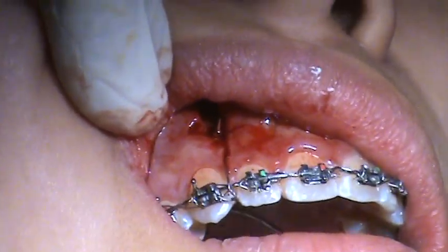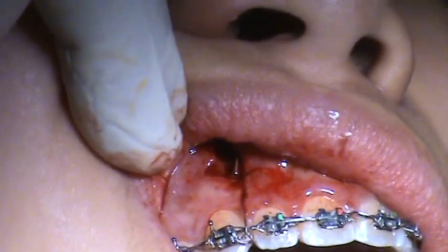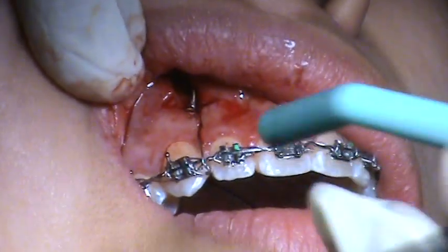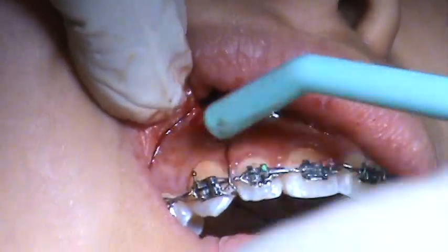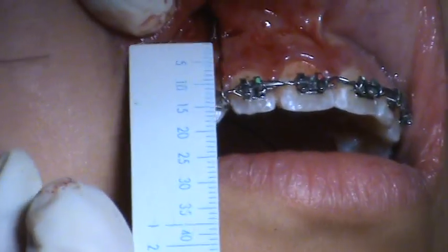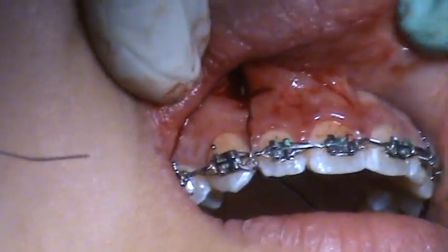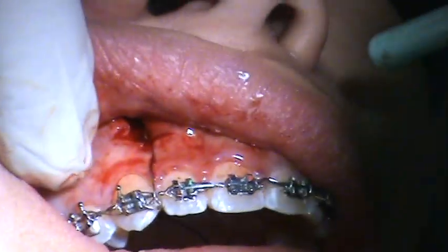Let's measure what that looks like — how many millimeters that is. There's a white ruler in the middle. Okay, we have, from the CEJ to the arch, I see 11 millimeters. Let's say 10, because the last millimeter I doubt we can get anyway. So let's just say 10.